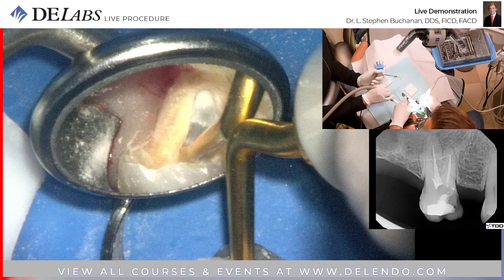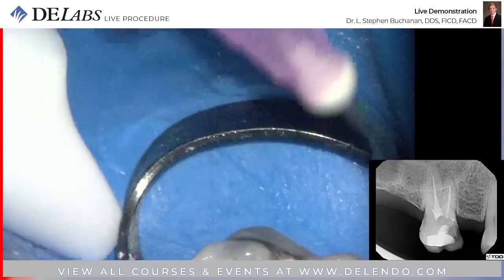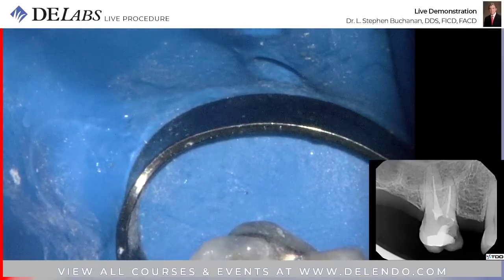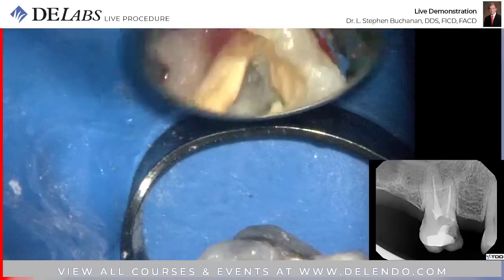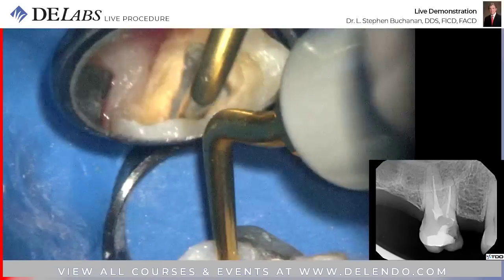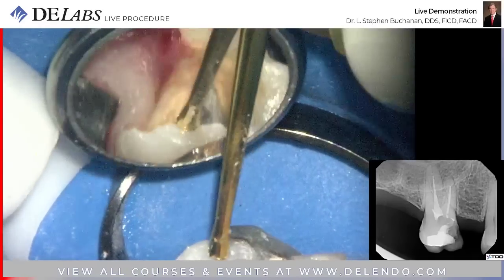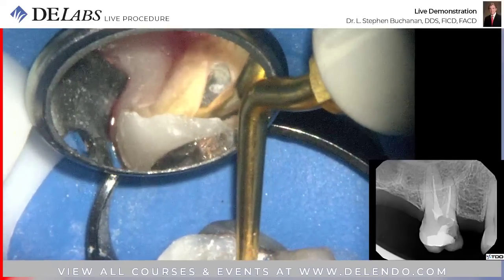Okay. And what really happens, I've already talked to you about how sharp-ended dental tools are almost none of them appropriate for endo. This is flat-ended. The ultrasonic tip is round-ended. That's really what you want. And when you use a flat or round-ended device and you cross an isthmus, it will light up like a stop sign. I'm going to cut this a little further mesially.